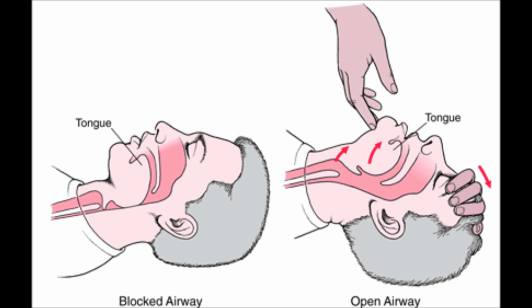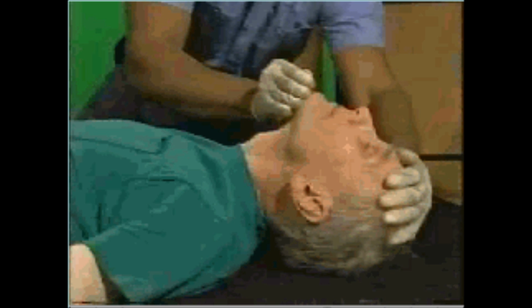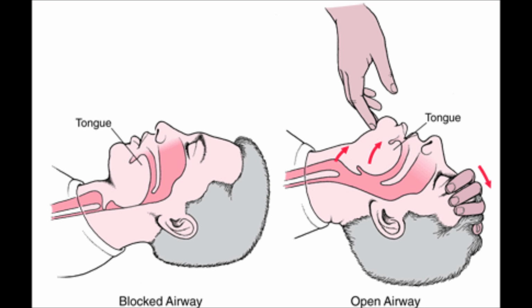If your patient is at risk for developing airway obstruction from the tongue or from relaxed upper airway muscles, then you have to use the OPA. The OPA is also used in unconscious patients. What else is the indication? Let's say you are performing a head tilt, chin lift, or jaw thrust, and these maneuvers fail to provide and maintain a clear, unobstructed airway, then you have to use the oropharyngeal airway or the OPA.